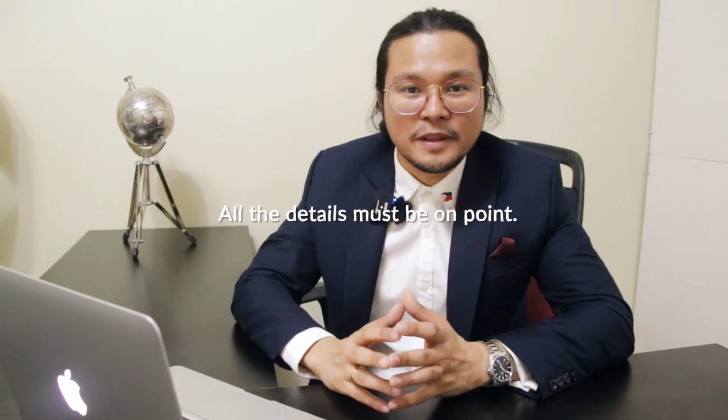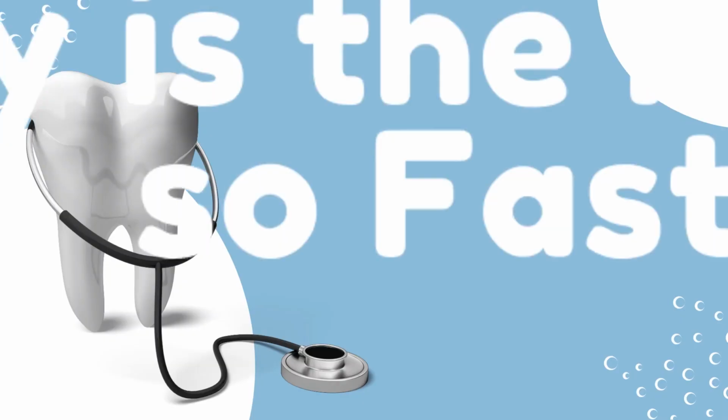And that's why we really have to make sure that all the details must be on point, so that it will prevent us from having problems and difficulties after or in the future. So yeah, doing it right from the very beginning is very essential. So after the try-in, patient agreed and happy with the appearance, everything. So yun, nag-decide kami, the patient, na ituloy na namin the cementation process. Like the try-in, siguro mga 15 minutes lang, and then after that, boom, ready na kami for final cementation.